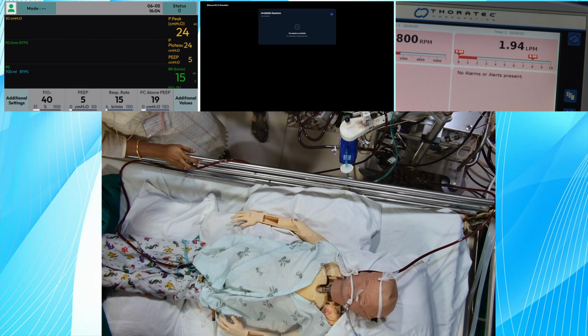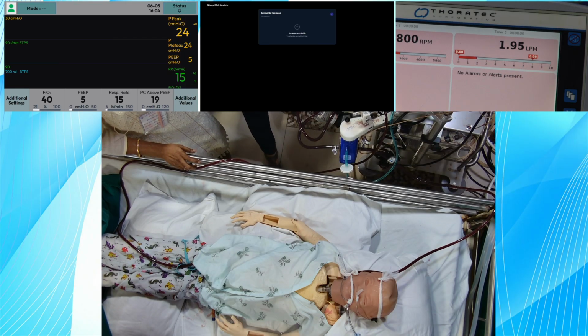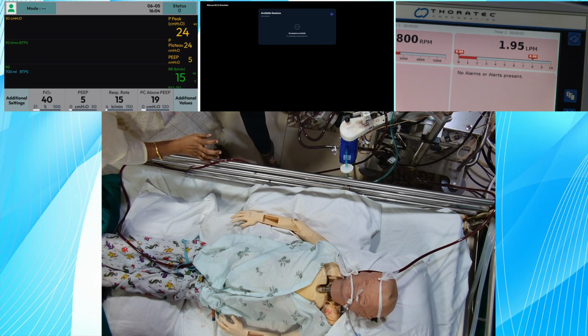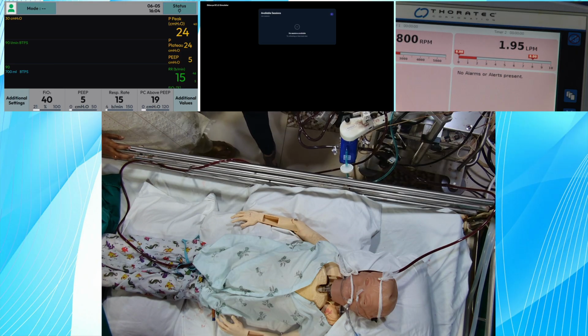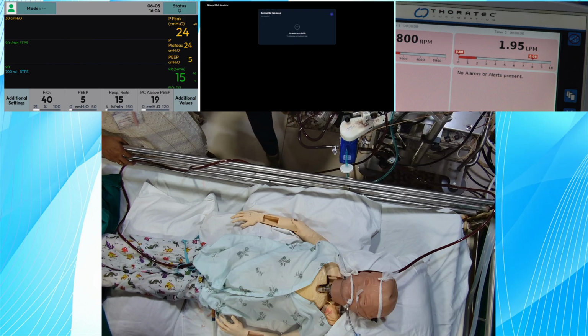P2, P3 difference is less. You want an oxygenator? Okay, give them an oxygenator. Change the oxygenator. But the delta pressure, has it changed? We are not sure. Delta pressure was the same. If there is a clot, the delta pressure should rise.